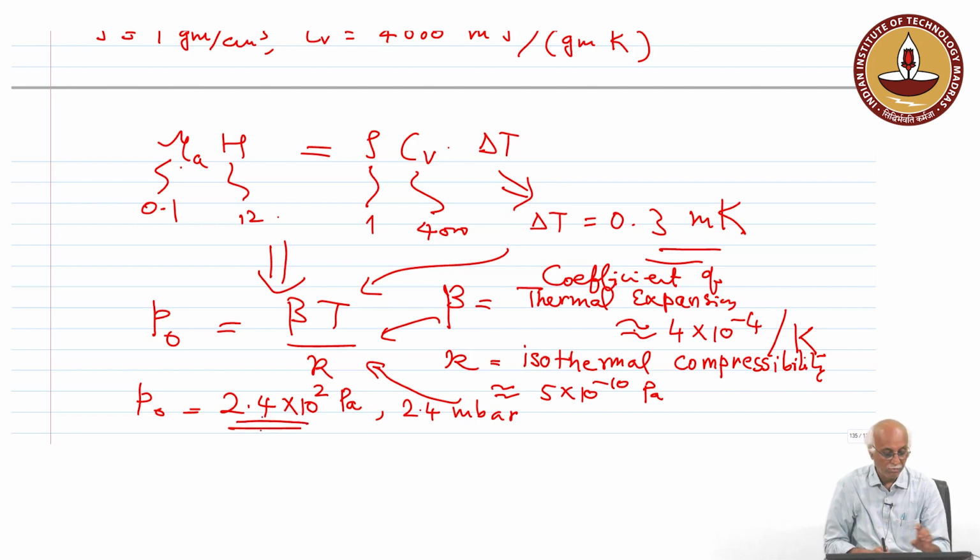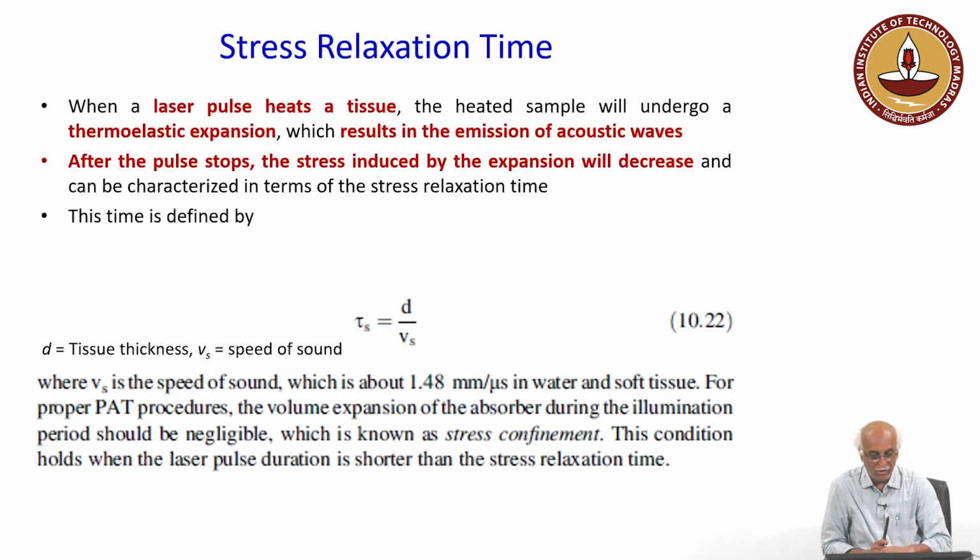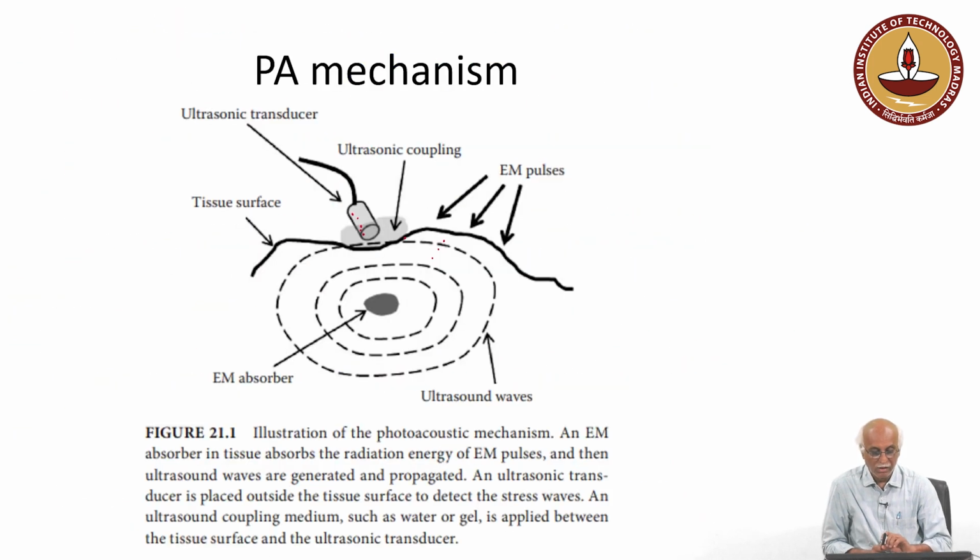but this is sufficient to generate the acoustic waves, and those acoustic waves are captured. So, if we try to see those aspects, what we do is use an ultrasound detector, an ultrasonic detector, which is a piezoelectric detector.